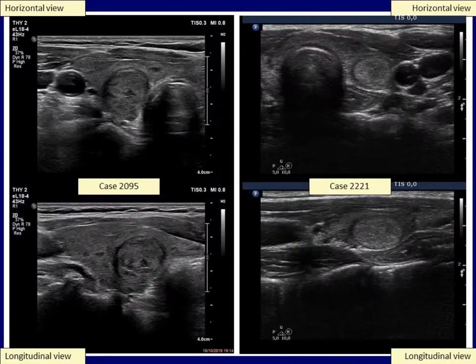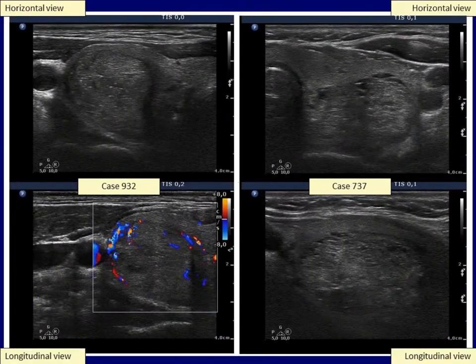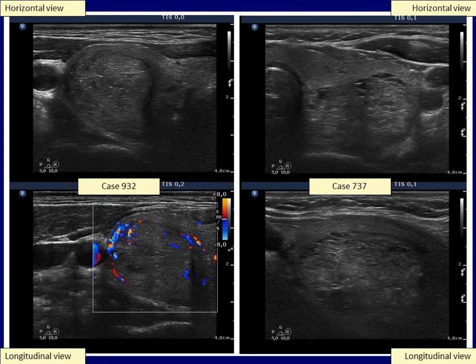In these two small nodules, the presence of halo sign is obvious. Note the complete ring around both nodules. In larger lesions, it is more difficult to visualize the complete ring in the same section. In the left nodule, the halo is almost complete, but in the right case, the halo can be seen only in part of the circumference. Both cases proved to be follicular adenoma and therefore had to be surrounded with a capsule.